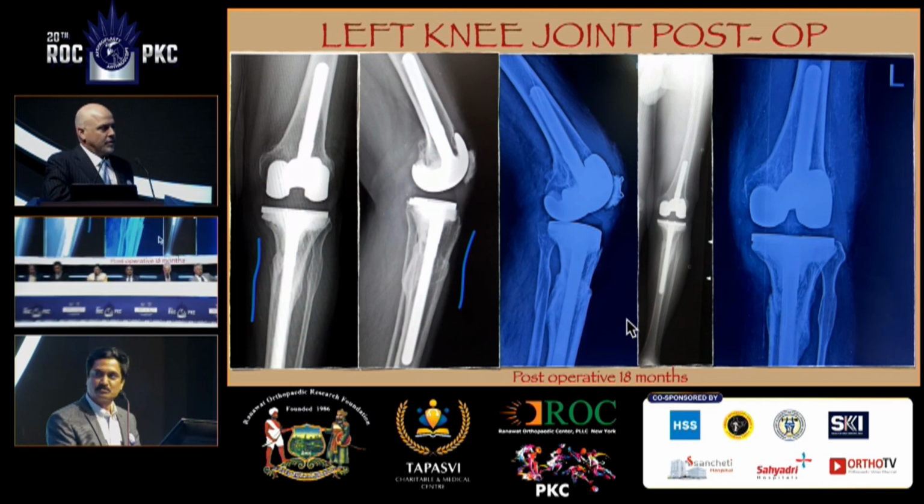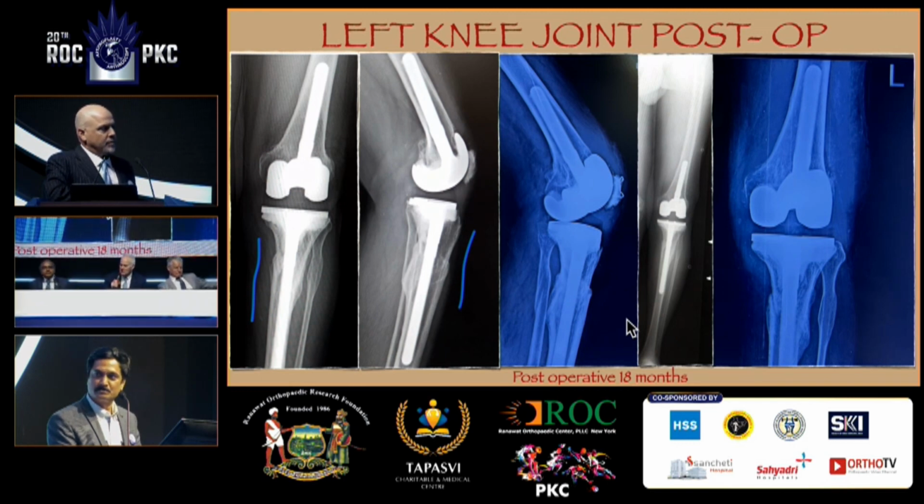I think it looks very good. I think the whole question there revolved around whether it was going to turn out to be infected. And I was suspicious it was going to be. Apparently it wasn't, but I was suspicious about it, just like Thorsten was. And if you'd gotten in there and it looked infected, I think that would have really changed the whole plan.